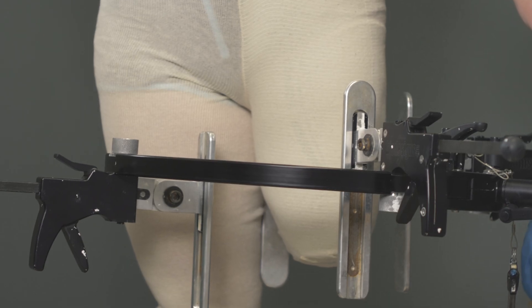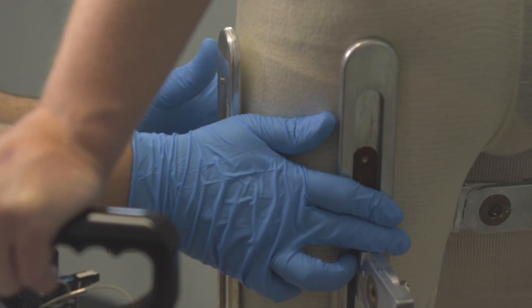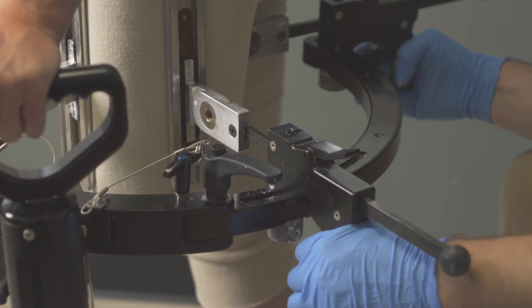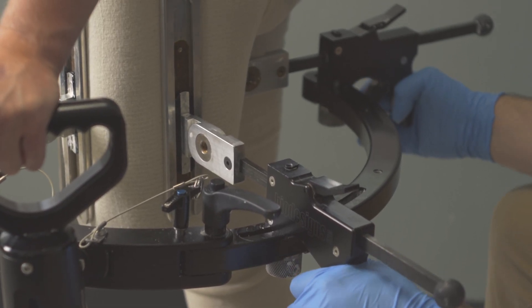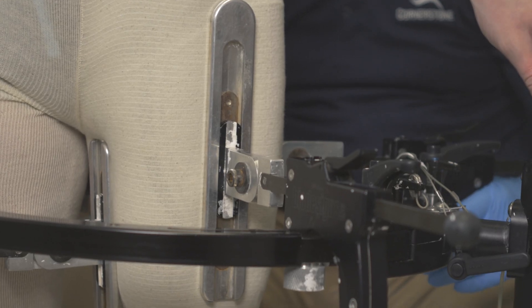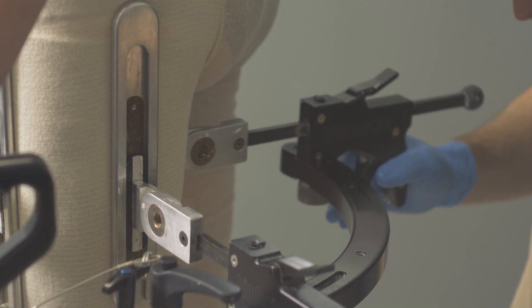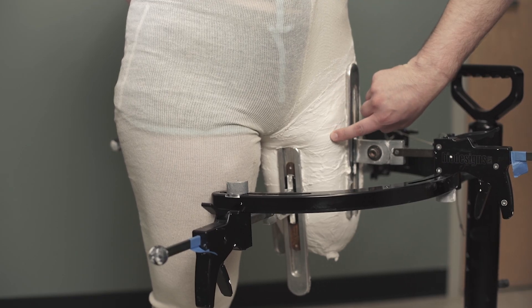The way we accomplish getting the shape for the Hi-Fi Socket is we have a special casting stand. On the stand, there are four adjustable paddles that help us get the desired compression zones on the residual limb. The compression release zones go in between the muscle bellies to isolate those around the limb. This helps provide osteostabilization that gives the patient a great sense of control through the socket and really stabilizes the femur.